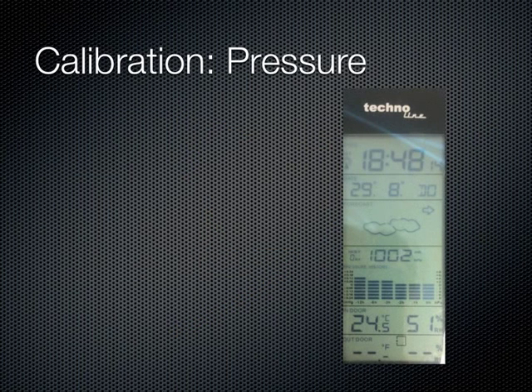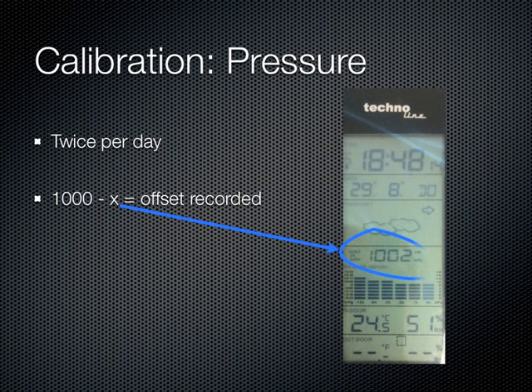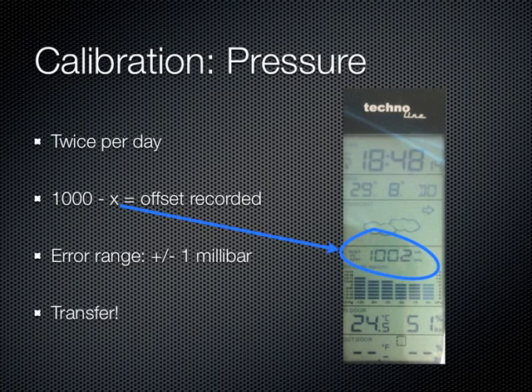Unless the altitude of the room changes, the pressure in the room will not change very much. Therefore, we only calibrate the pressure once in the morning and once in the afternoon. The default setting for the test is 1000 millibars. The number recorded in the calibration log, however, is the offset from this number. Once the measurement is taken, we check the pressure reading to ensure that it is within the acceptable error range of plus or minus 1 millibar. We then transfer the offset number to the calibration log.